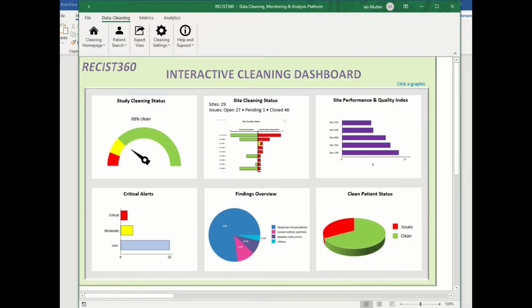Having worked in clinical trials for a number of years, we have seen repeated difficulty in reviewing RECIST data. For this reason, we recognise the need for the development of a tool that can be run across any data source, whatever the EDC application, or indeed even for studies that are conducted with paper CRFs. Such a tool must also eliminate the need for double data review.